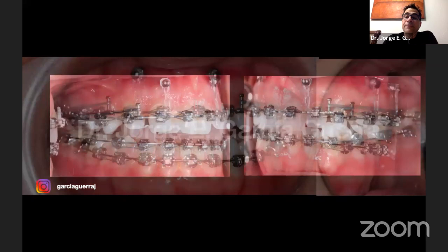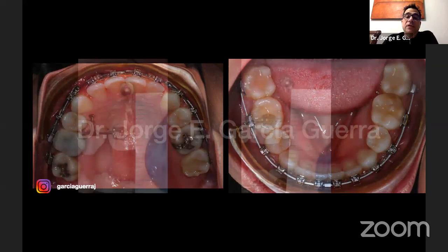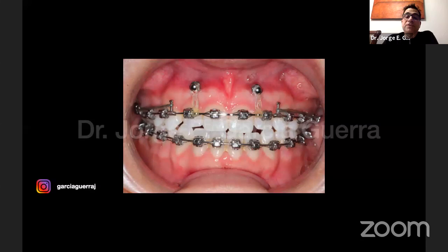We still have a few spaces there in the upper. And we always measure to see the difference between the sides. Now, this is September. I took this picture when she came in the office. You can see that the chains look a little bit yellow because I was gonna take the mini implants off. You can see the one on the left of the patient, that was a little bit lower. It was beginning to loosen. It was beginning to have a lot of mobility.